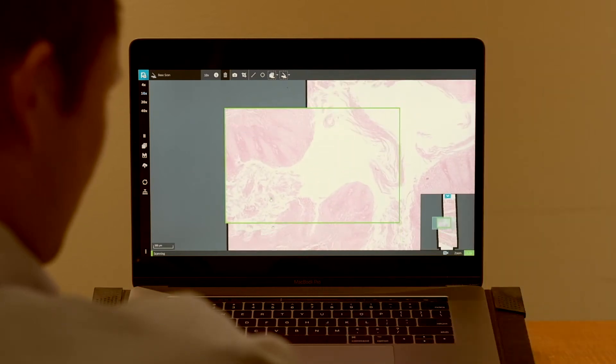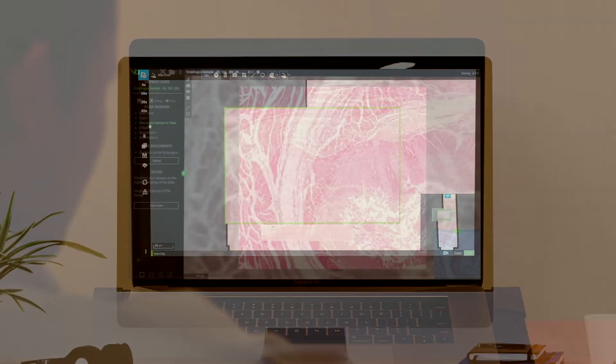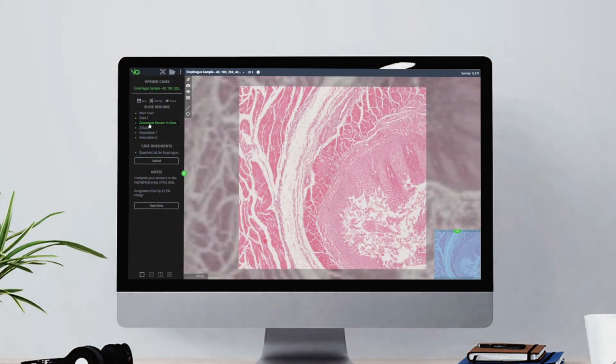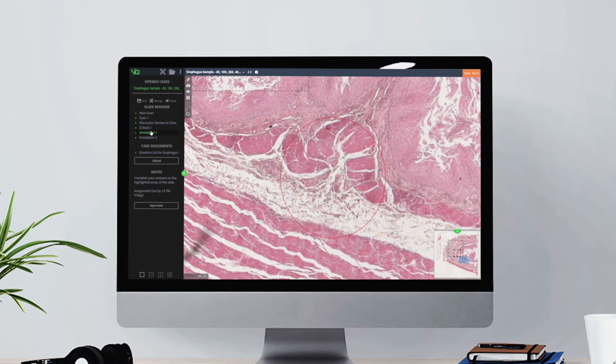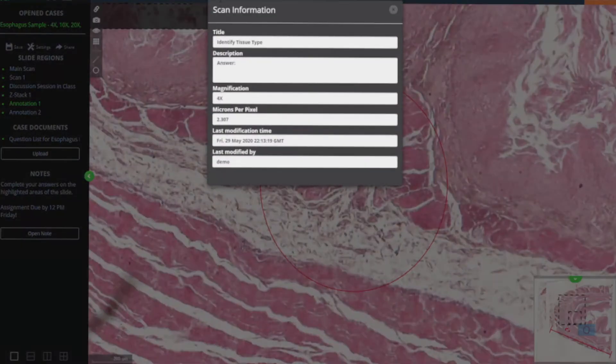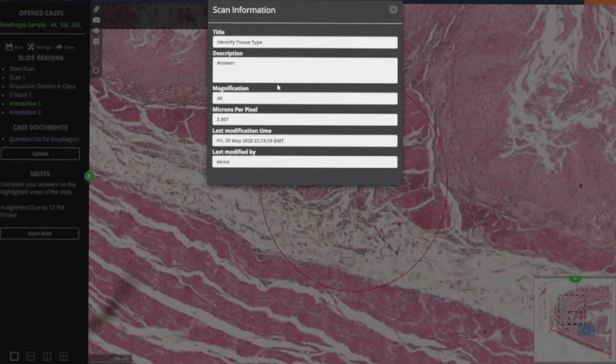Educators can take advantage of the cloud-based portal Panoptic.net to share scanned images with any number of students, either remotely or in person. Panoptic.net also simplifies presentations at conferences and tumour boards.